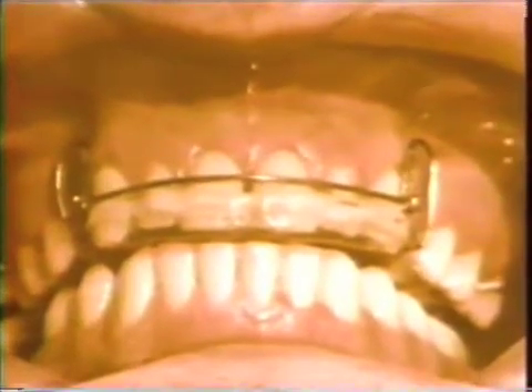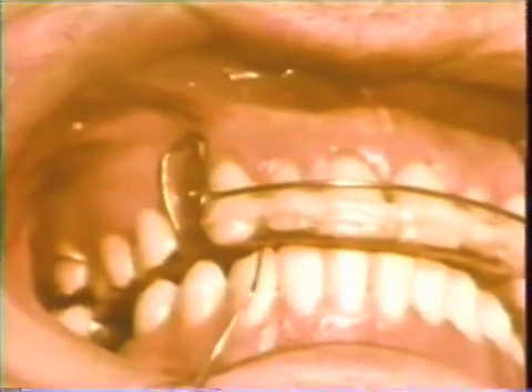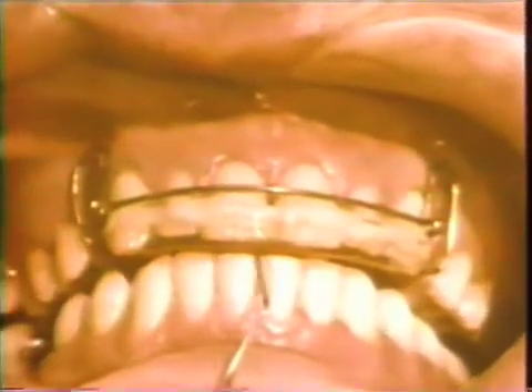This is a holly bite plane that was used to permit further eruption of the posterior teeth. It was then used to close the diastema between the two maxillary central incisors. The labial arch wire and elastics help bring the maxillary central incisors lingually and mesially.